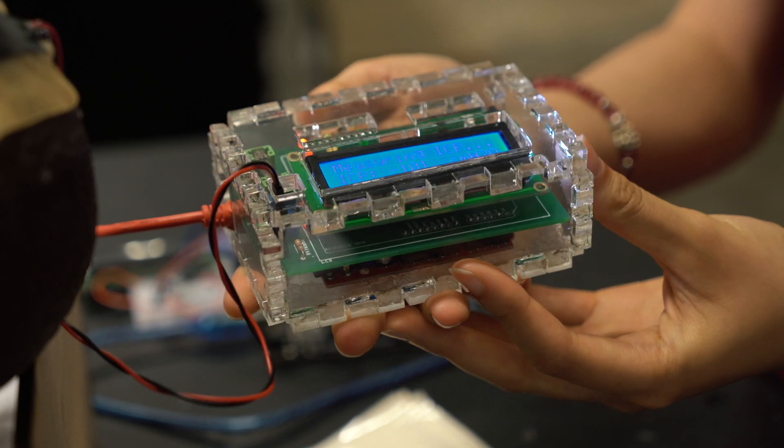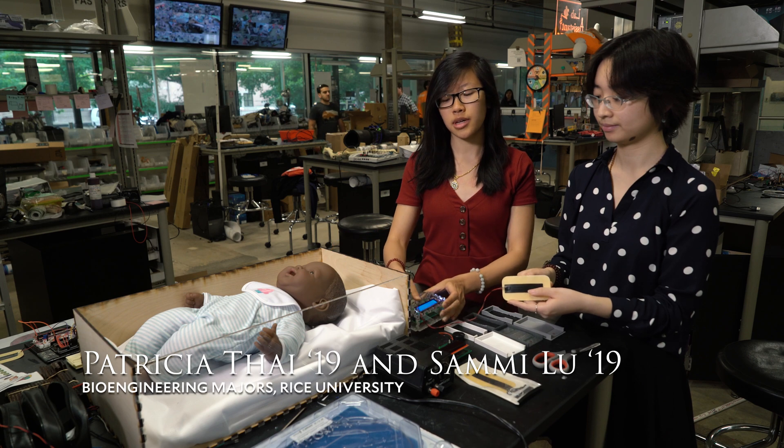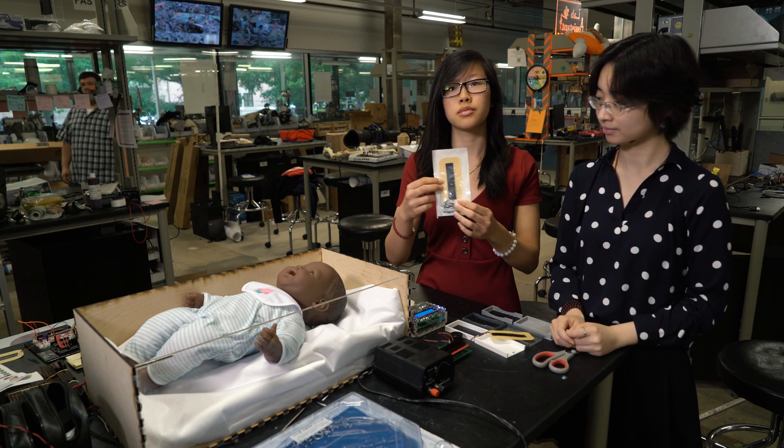So this is our device. This is the reusable portion of the device, and this would be a one-time purchase for the hospital. This is the disposable portion — this is how it would come, and each patient would have one of these when they're being used.